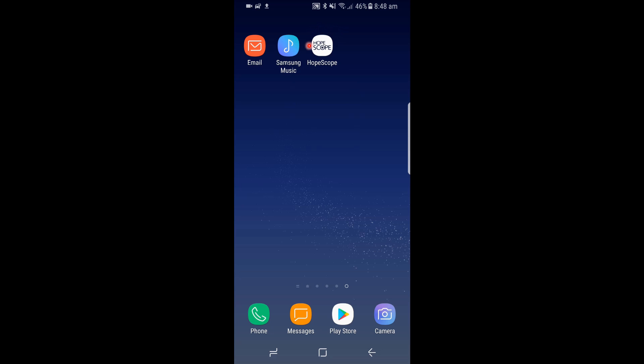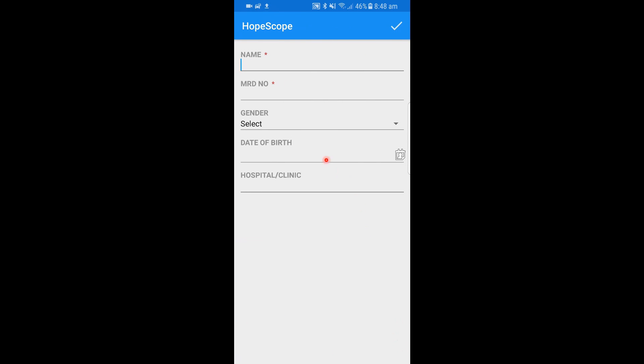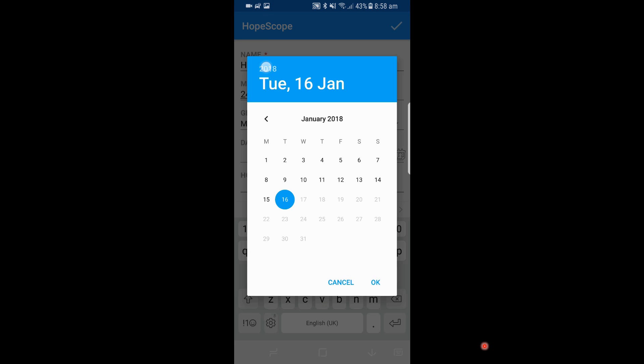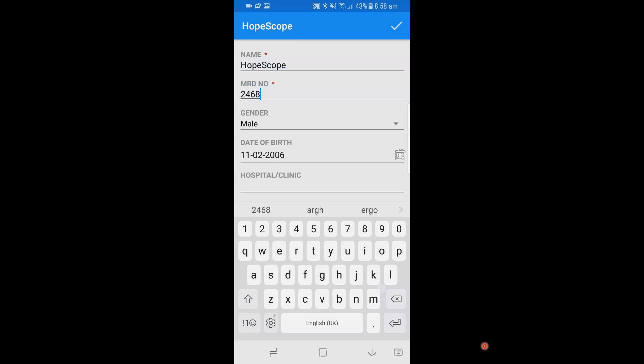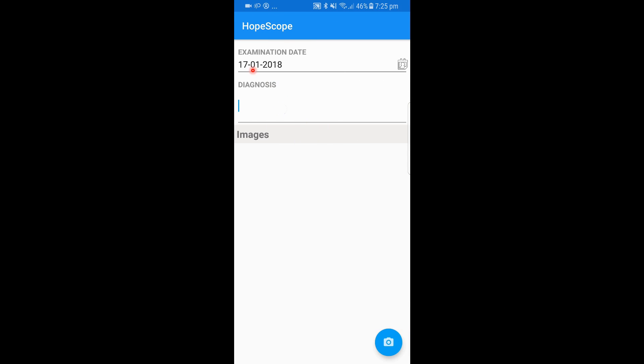This is the HopeScope Android app. It opens into the database where you can add a new patient. There are mandatory fields — the name and MRD number — without which you cannot proceed. The gender is also required, while the date of birth and hospital name are optional. After adding the patient, you can go to the visit, where one can give a visit-specific diagnosis and then proceed to the capture screen.